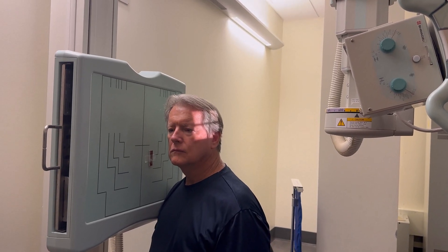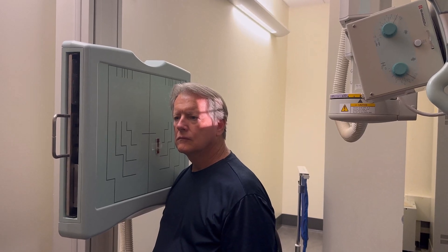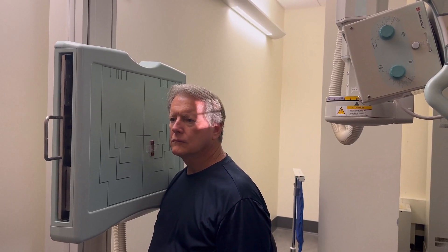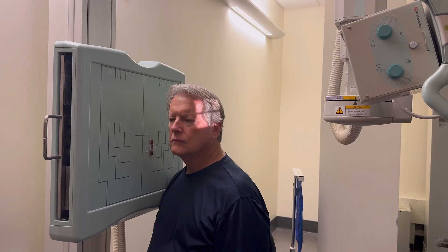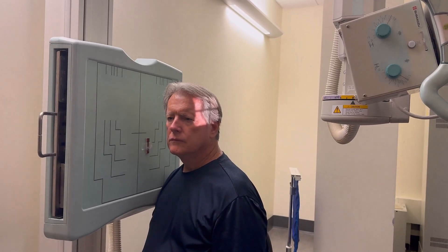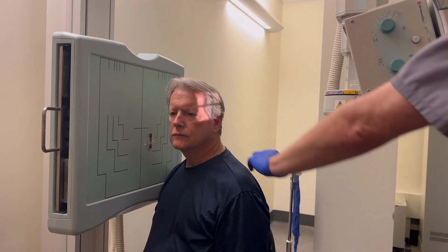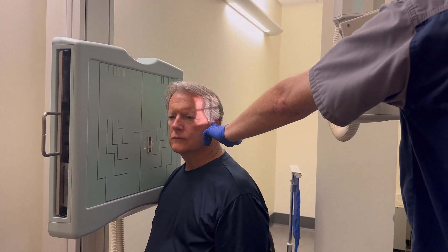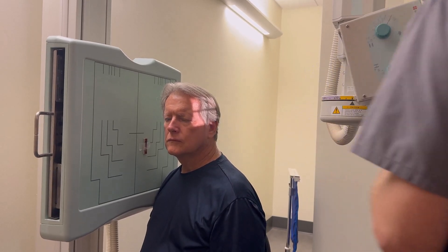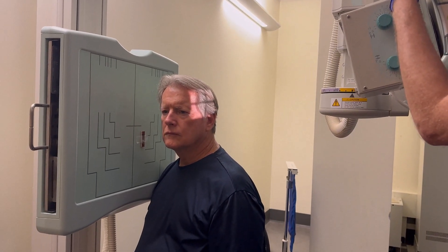I want you to look right at me — we're lining up the interpupillary line. So we're going to tilt the top of your head and then turn to follow my face. A 15 degree caudal angle means I want to be about an inch and a half above this upside TMJ, so I could drop this just a tiny bit here.